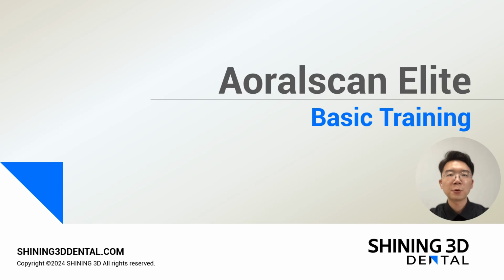Today's basic training will be divided into 4 different parts. The first part is the introduction part. I'm assuming that some of you may already be familiar with this new device, but in this introduction part, we will use an actual all-on-6 case to give you more information about this new device.